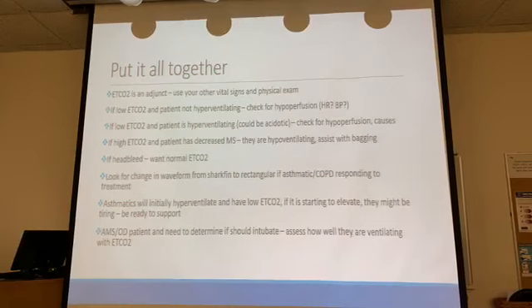Asthmatics, remember what I said, initially they're gonna be hyperventilating because they can't breathe. So you're gonna see a low end-tidal CO2 on these patients. If you start to see that end-tidal CO2 starting to go up, the patient's getting tired, he's slowing his breathing down, he needs help. So keep that in mind.